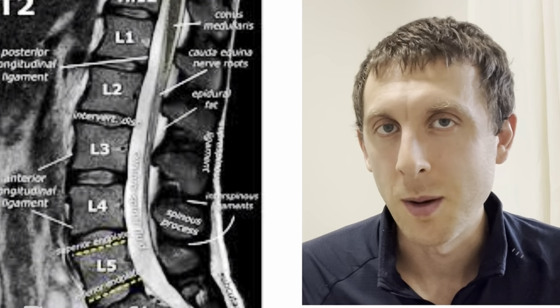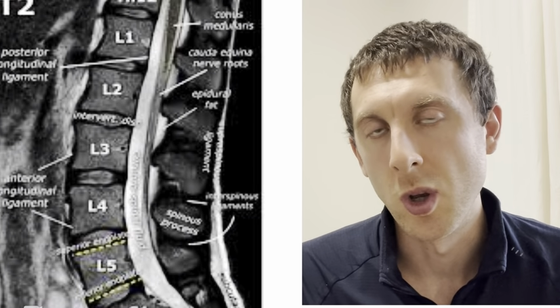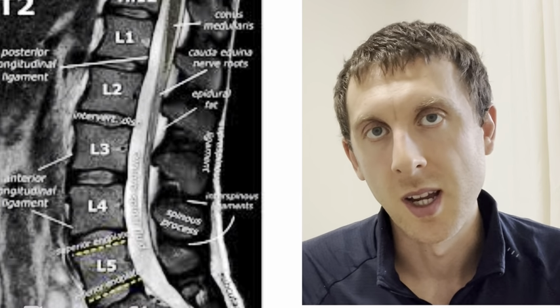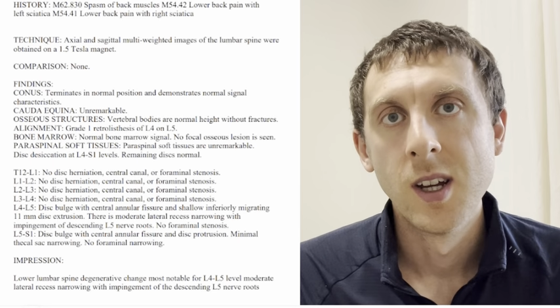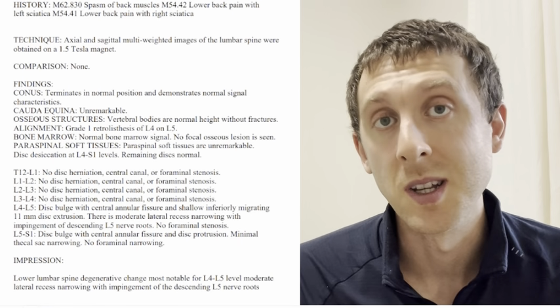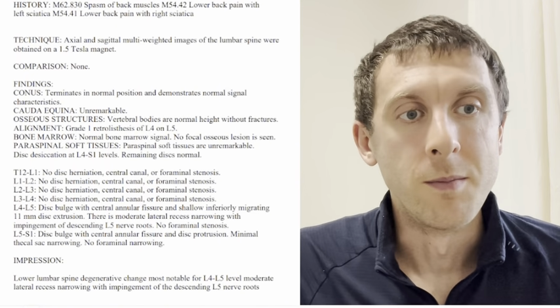So if you've ever had an MRI for a neck, low back, or mid-back pain, I want to go over what some of these terms are and what the significance of it is, to hopefully give you a little bit more confidence in reading your MRI if maybe somebody didn't go over it with you. Okay, so let's get started.